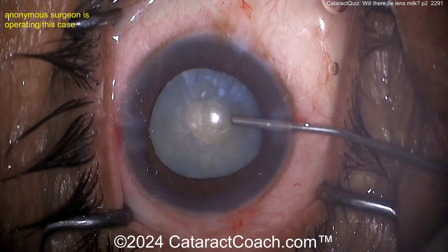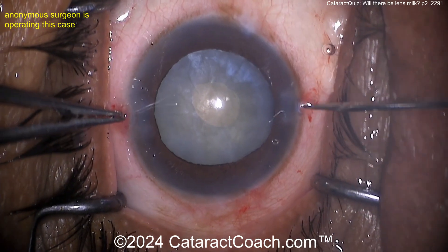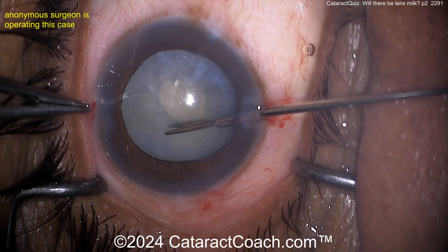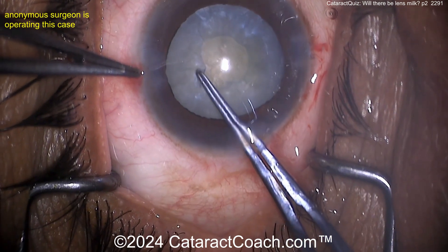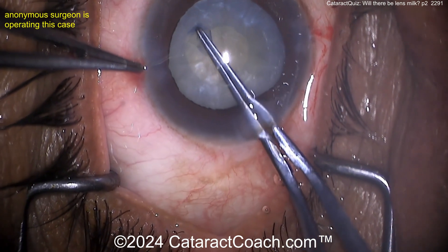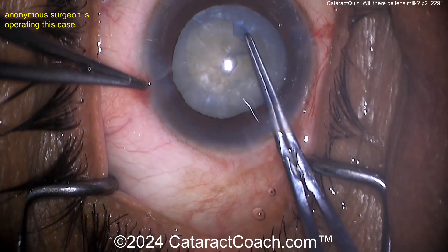Putting in some viscoelastic. You can enlarge that rhexis — you can use our system again, just nick the capsule, or you can use micro scissors — look at those fancy micro scissors — to nick that capsule. Let's complete this rhexis. Do your five to five-and-a-half millimeter rhexis, and your risk for Argentine flag sign is essentially zero. Very nicely done.